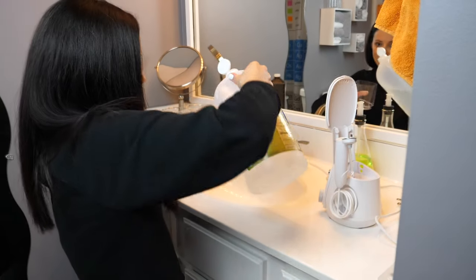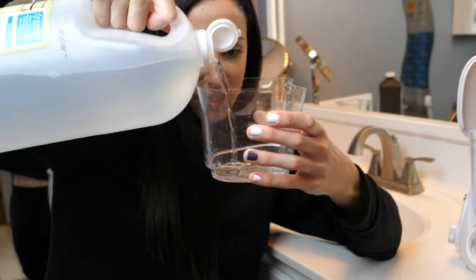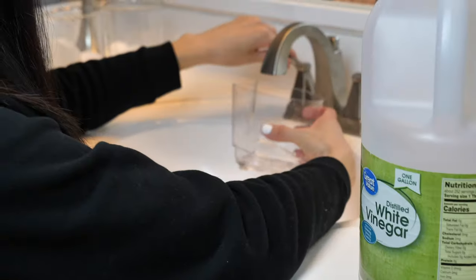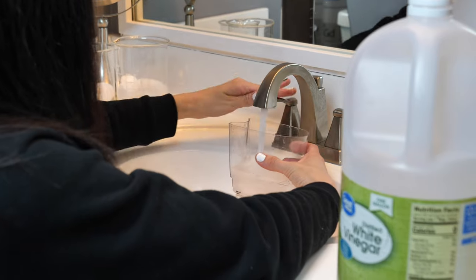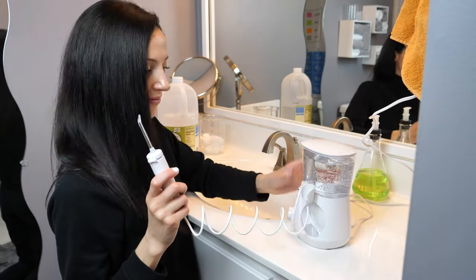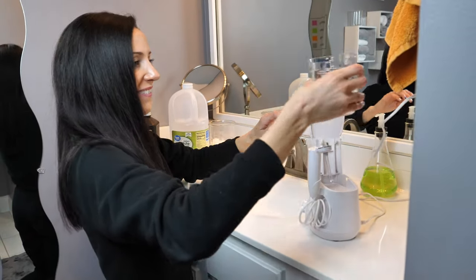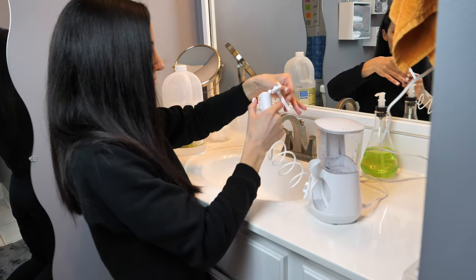Now I clean the internal parts — the lines that the water flows through. Based on which model you have, the amount of vinegar will vary, but I put about two tablespoons of vinegar and eyeball it into my water basin, then fill the rest up with warm water. I run the lines until they are dry with this warm vinegar water mixture. After that, I run the lines again, this time with water only, filling it up 100% with water. This helps get that vinegar taste out.